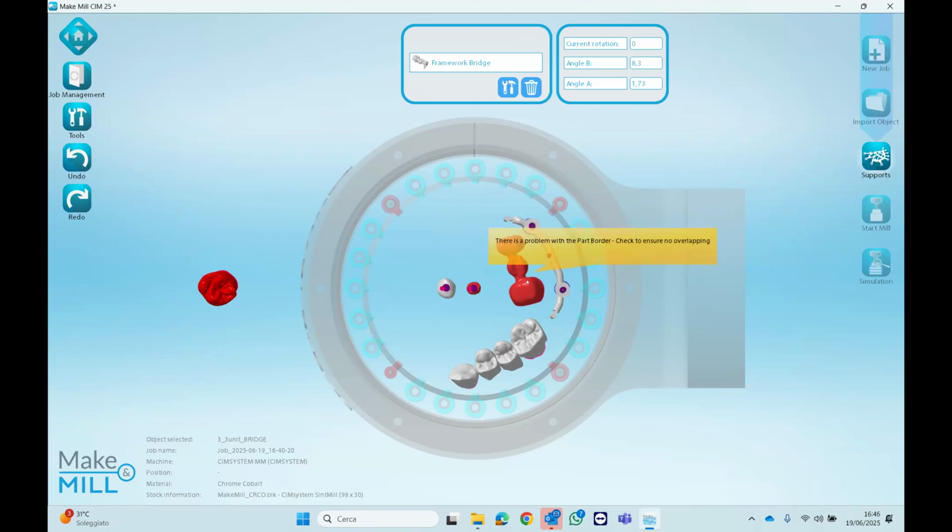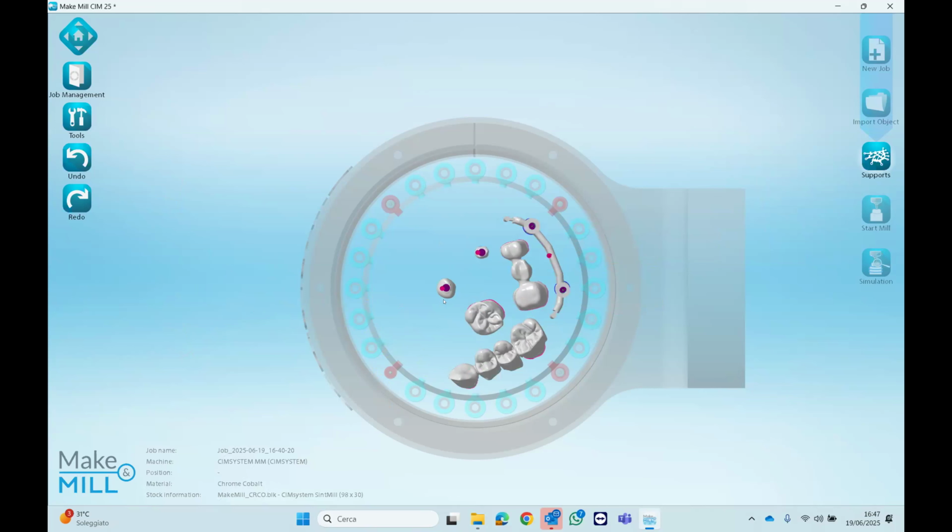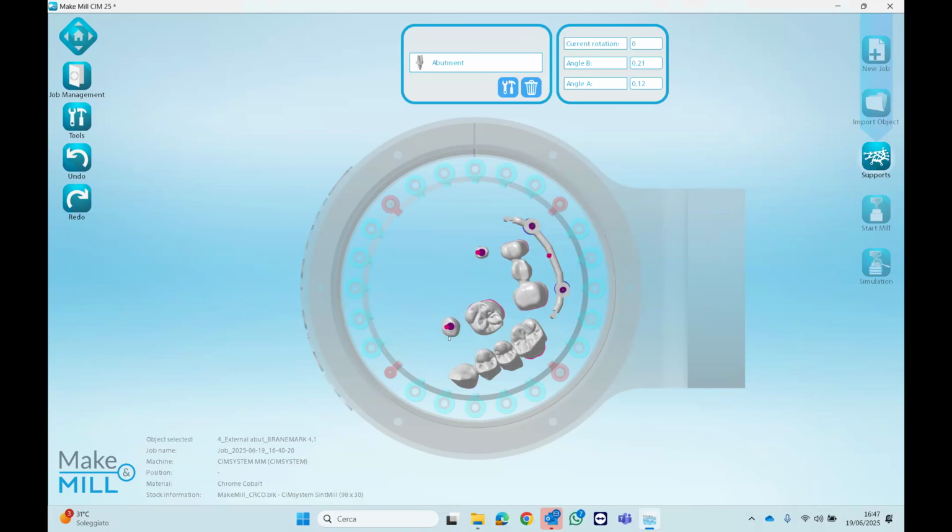And so I will put it right here like this. We can get this one here, put it over here somewhere like this. And we'll grab this one here, put it over here like this. And we can grab this one here and bring it down here. Okay. So once we have everything about set, we can start to analyze our object.